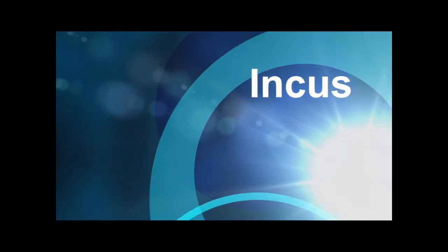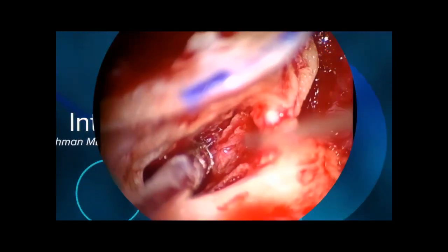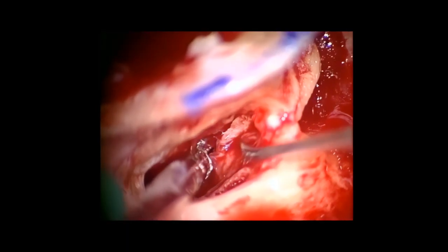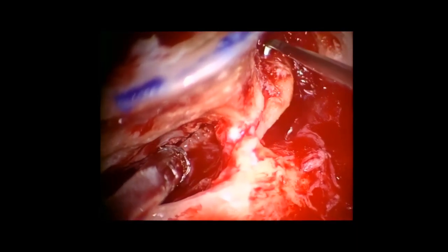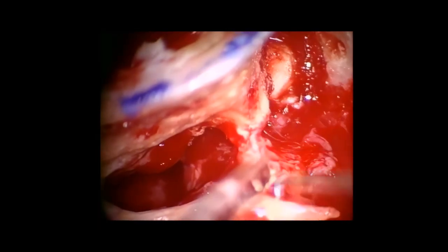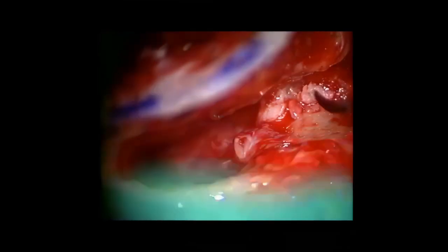In this video, I will demonstrate the ossiculoplasty technique using the natural incus. This patient has a discontinuity of the incus and the stapes due to chronic ear infections. You can see here that the incus is not connected to the stapes, and there is a large amount of surrounding inflammatory disease. I have already completed a mastoidectomy and removed the incus. Now we are cleaning up any inflammatory debris, and now I am palpating the stapes superstructure to see that it is intact and mobile.